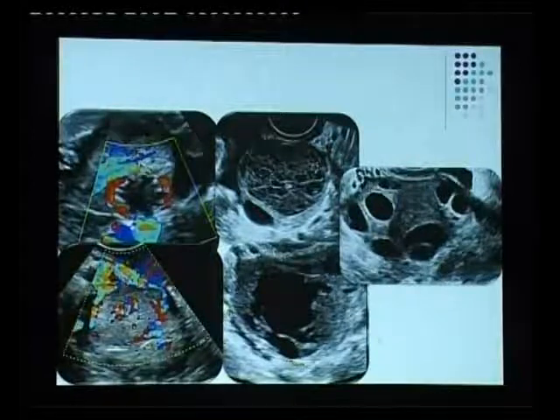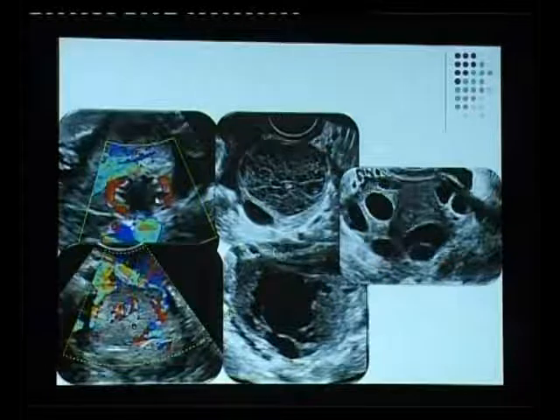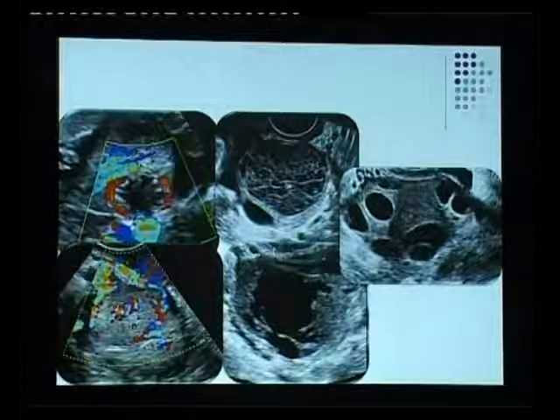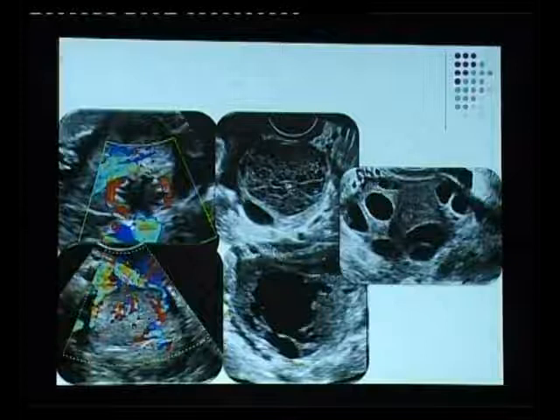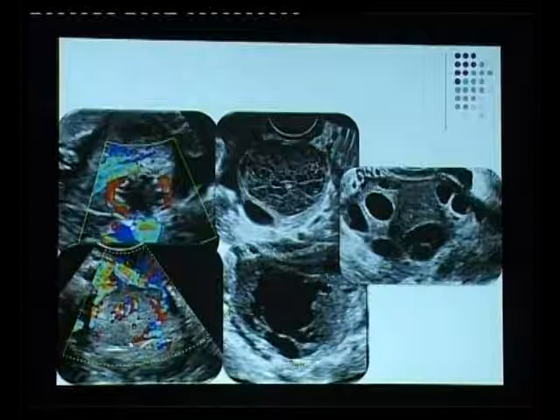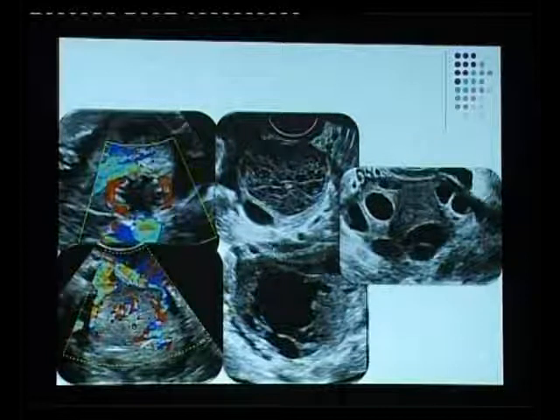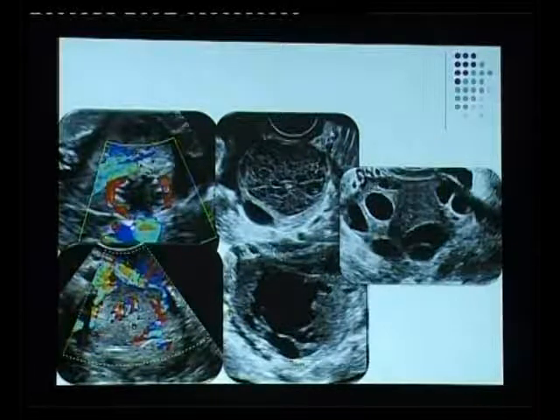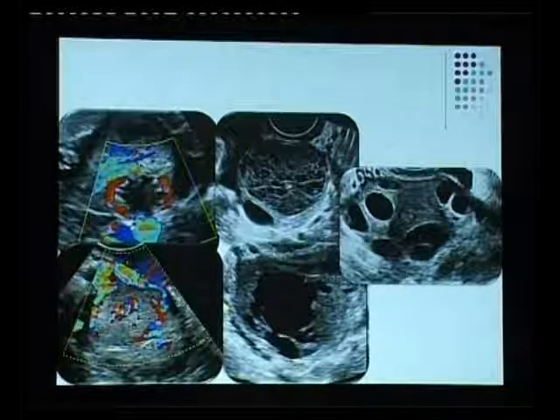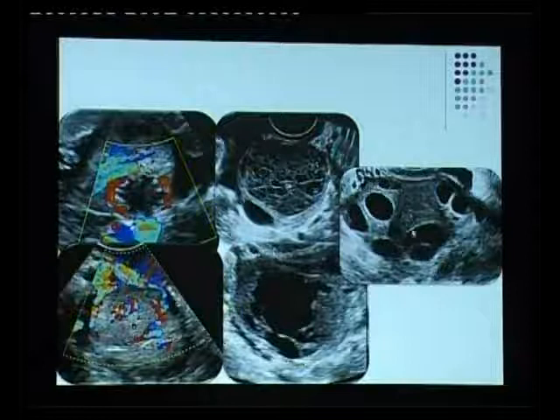If it is a lesion with a thick wall and internal echogenicities, of course the vascularity is again going to help you. If you see this lesion in the secretory phase, first think of a corpus luteum, put on a Doppler, nice low resistance flow, and it has to be a corpus luteum. The corpus luteum sometimes may have a typical look, but sometimes it may appear just isoechoic to the endometrium. It is only by Dopplers many times that you can pick it up. If it is a hemorrhagic cyst, it will show no vascularity, because a hemorrhagic cyst is not a hormonally active cyst. And again, it may present in any of these ways, because it's ultimately degenerated blood which is inside.